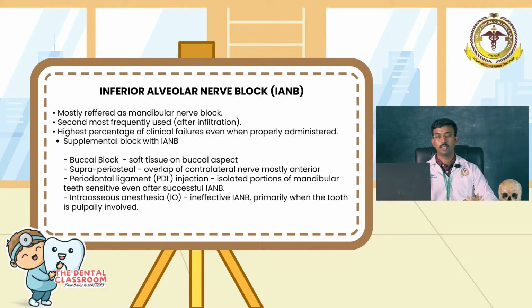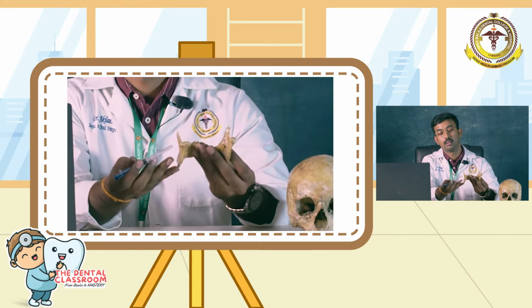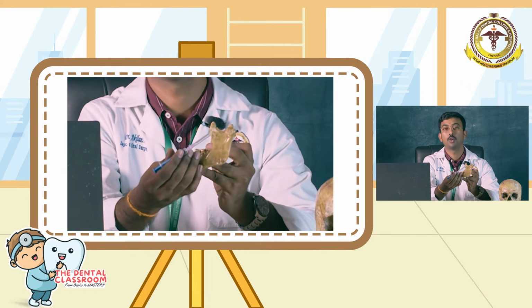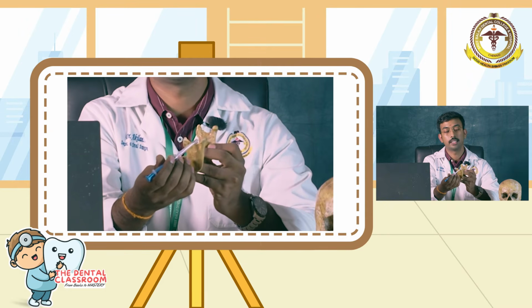Before discussing the inferior alveolar nerve block, I would like to discuss a few things about our mandibular bone and the parts of the syringe. So this is our human mandible, and the various parts include: this is our condylar process, this is the coronoid process, and the depression in between is the sigmoid notch.